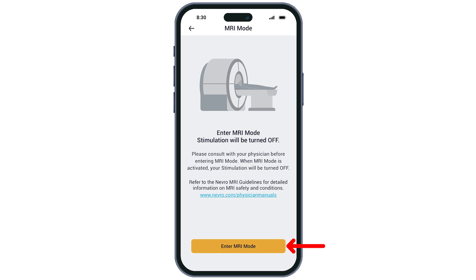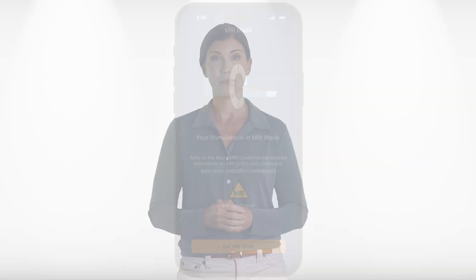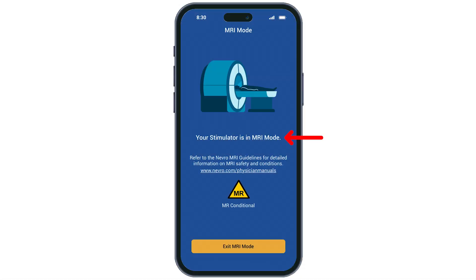You will then be prompted to tap enter MRI mode, followed by enter. You will know you're successfully in MRI mode and your stimulation has been turned off when you see your stimulator is in MRI mode on your screen.